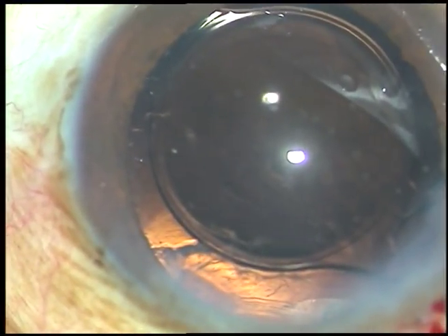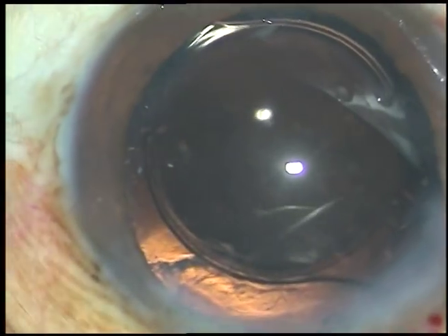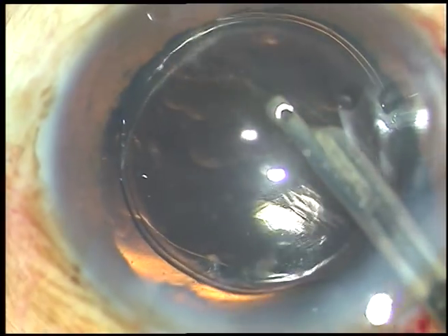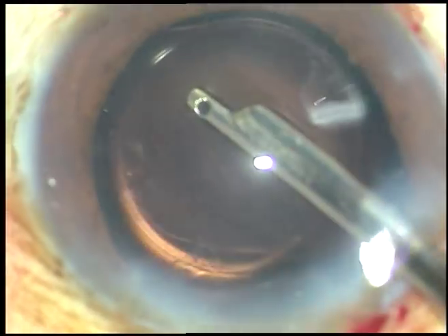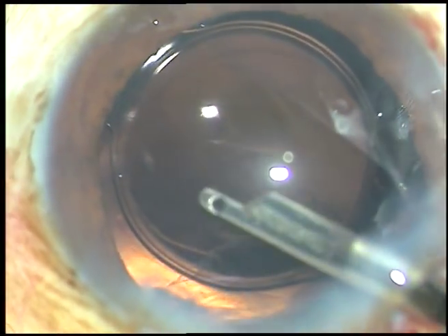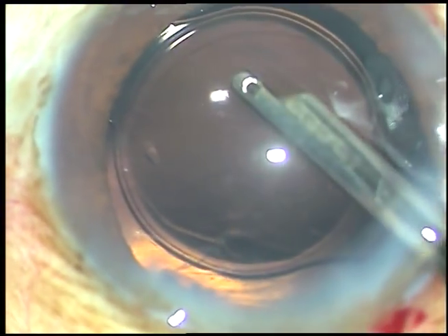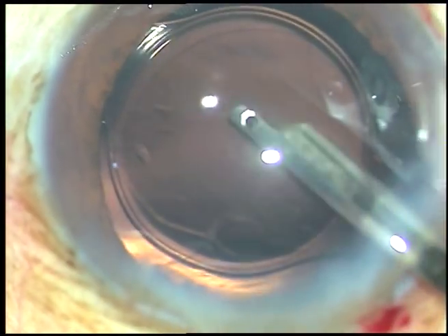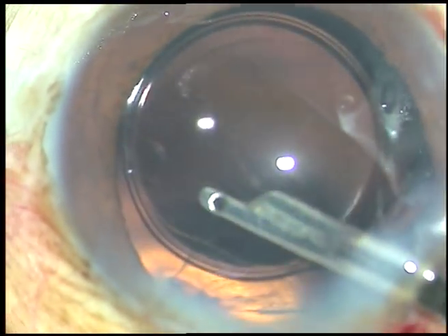Now I am going to clean the viscoelastic substance used in this case — that is hydroxypropyl methylcellulose. If I clean it to some extent and leave it, probably I can avoid vitrectomy. But as I am very thorough in other cases with cleaning of viscoelastic substance, in this case also I did that.